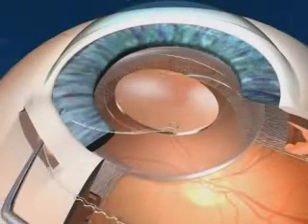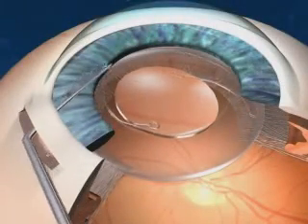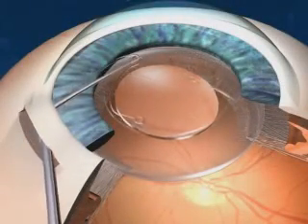Before inserting the trailing haptic into the capsular bag, please ensure that the anterior chamber and the capsular bag contain sufficient viscoelastic solution. The trailing haptic can now be rotated into the capsular bag using a Y hook.